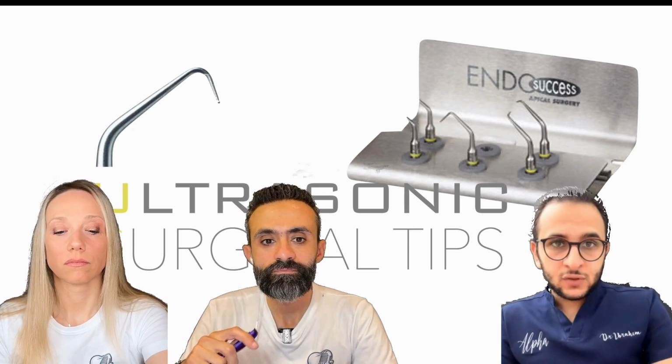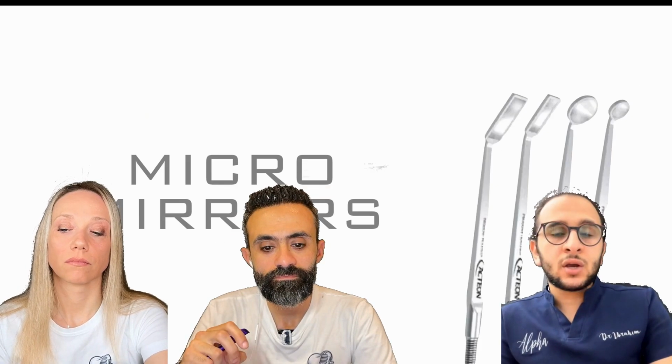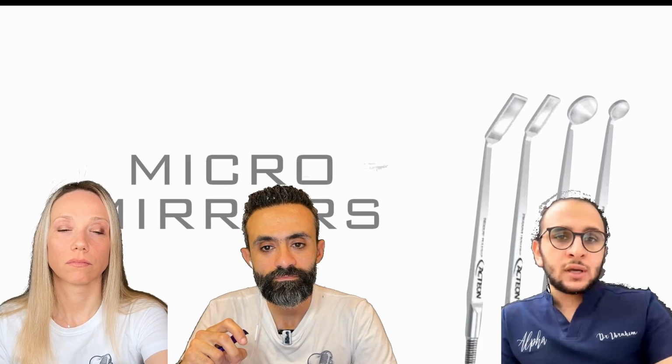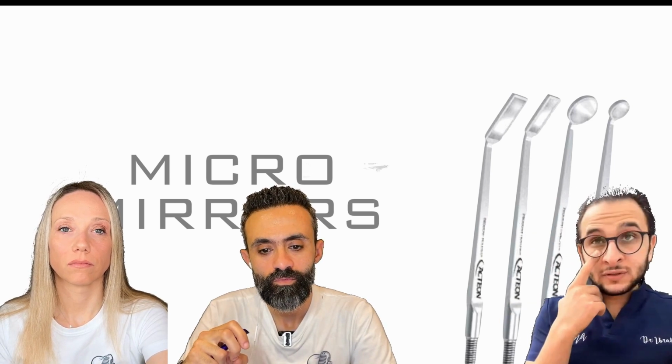Now we have to have a clear vision for the apical part of the root, and for this purpose, of course, we are using the micro mirrors to have a clear view, and we have two options of them, the round one and the elongated one, or the rectangular one. For most of the time, if I'm going to use just one mirror, I'm going to use the rectangular one because the round one, sometimes it doesn't go all the way inside.